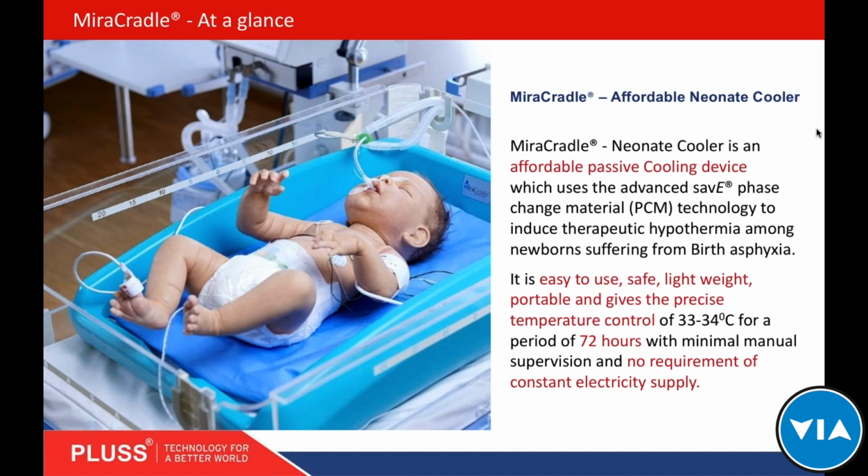However, use of ice packs was not validated. Due to the very low surface temperature at around 0 degrees Celsius, ice packs can cause a thermal shock to baby. It can induce a lot of shivering and can also increase the risk of subcutaneous fat necrosis. Moreover, ice packs have to be changed quite frequently, leading to a very high level of manual supervision.